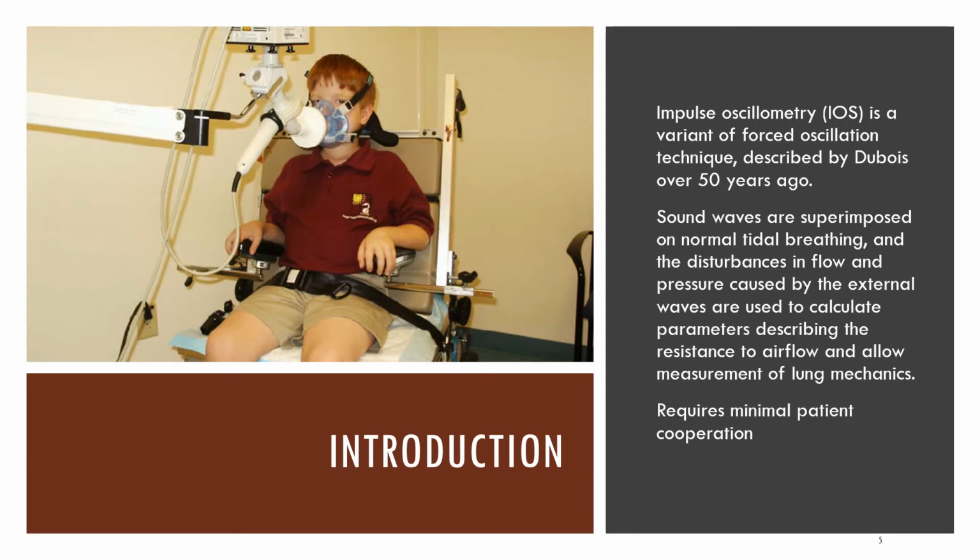So this is a great tool for patients with obstructive pulmonary disease, and because it really takes minimal cooperation from the patient, you could use it especially in children. They've done some studies where children could use this process because it really doesn't take much effort for them to do it. And it actually could identify small airway disease better than spirometry. So that's a little bit about it. We're going to get a lot more into it as we go along.